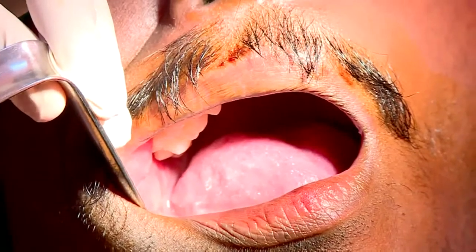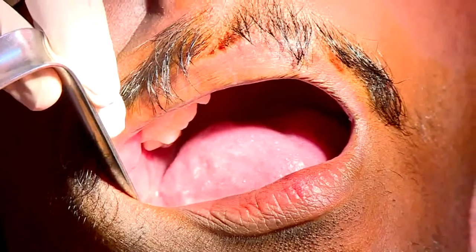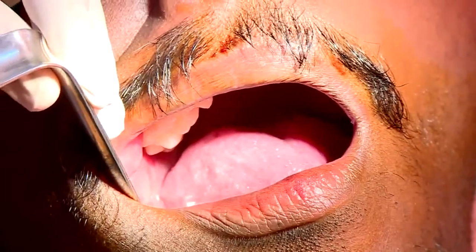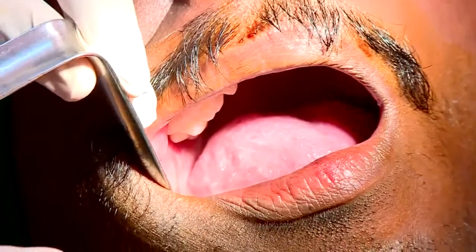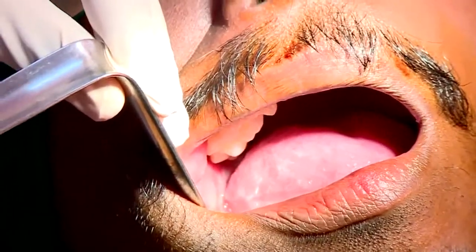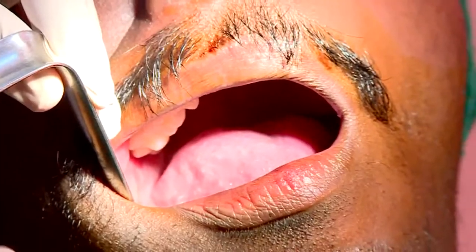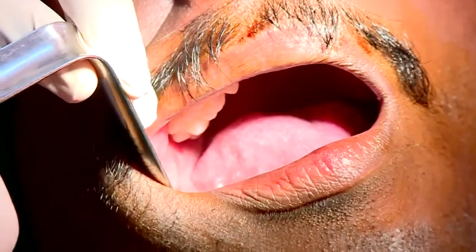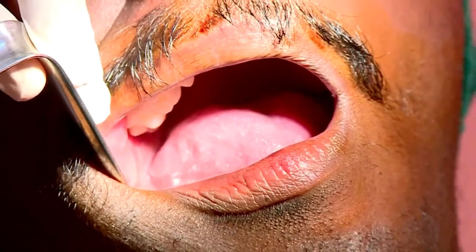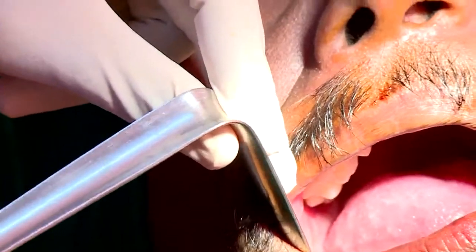So the procedure is like this. We are going to start the surgical procedure. It has a few steps. One step is just to make an incision. Okay, the incision. And the second thing is the mucoperiosteal flap. Both the incision and mucoperiosteal flap are to elevate the mucosa and periosteum to expose the impacted tooth, so that it can be helpful for bone removal and tooth removal.